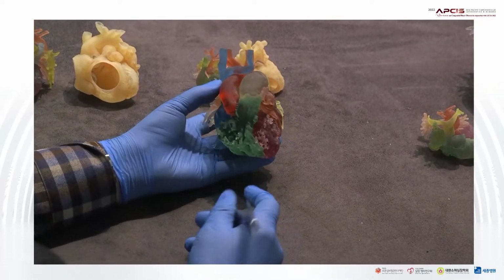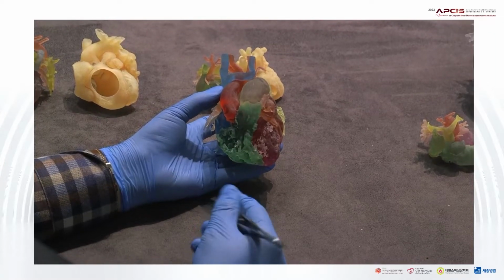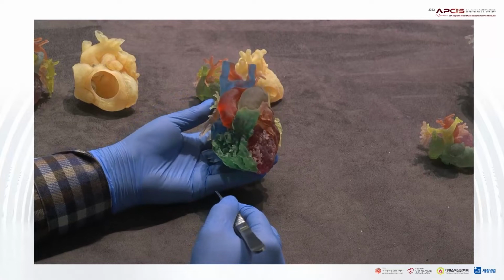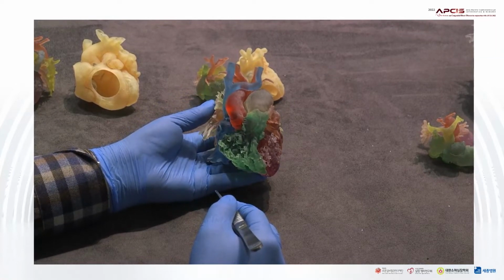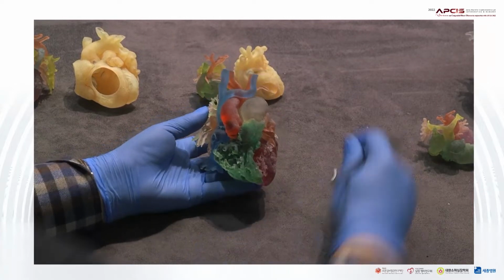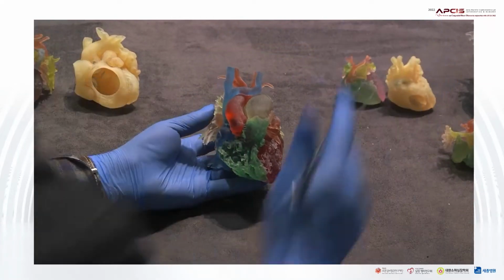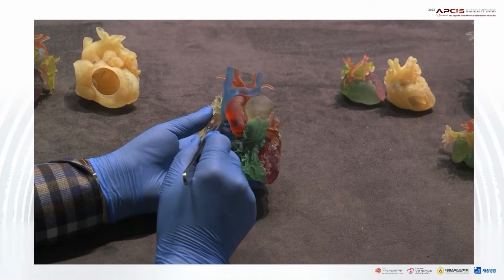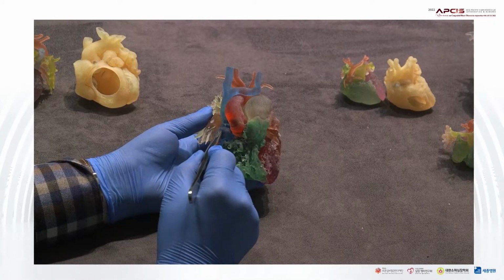This is a 3D printed model from a patient 18 months of age. First of all, we see the surface anatomy of this model. This is the SVC, this is the RA.